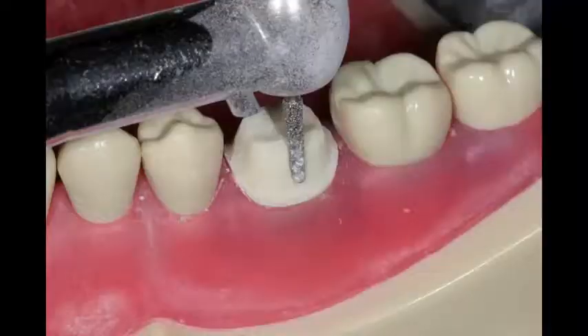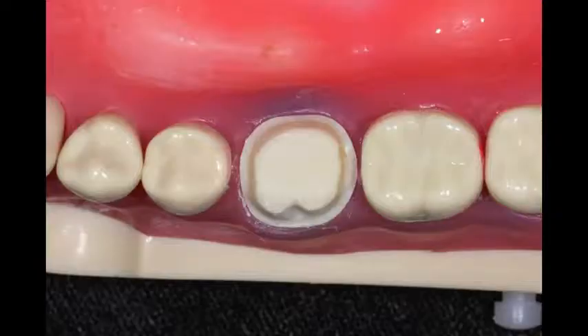Right before I'm done with the crown prep, I'll take the regular shaped diamond burr and place a groove on the buccal. It just helps add to the retention form. It's also going to help with having your temporary stay on better, and it gives the lab more retention for your crown when they're building it. That little feature has really helped us in our office quite a bit.